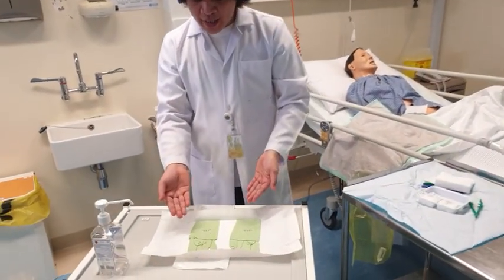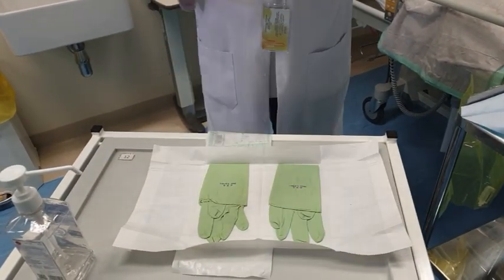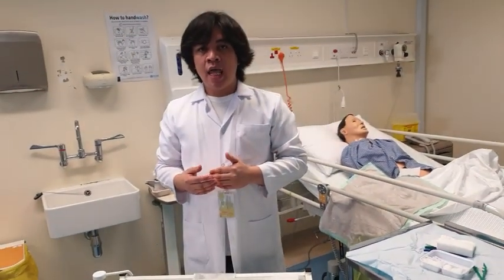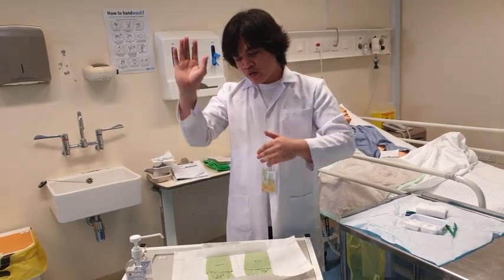There is a right glove and there is a left glove. It is properly labeled so that you will not be confused. Okay, how do you start gloving? Start with your non-dominant hand. Or you can start with your dominant hand, it's fine. So I'm going to start with this one.